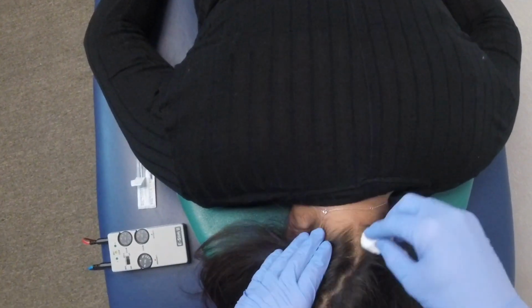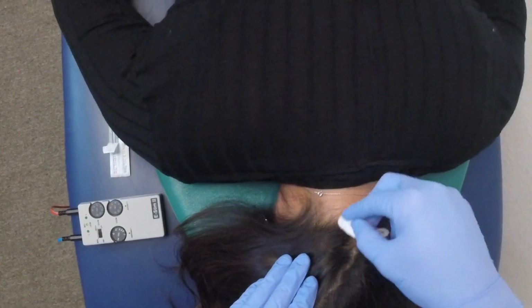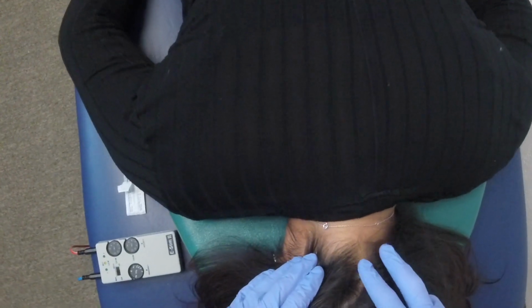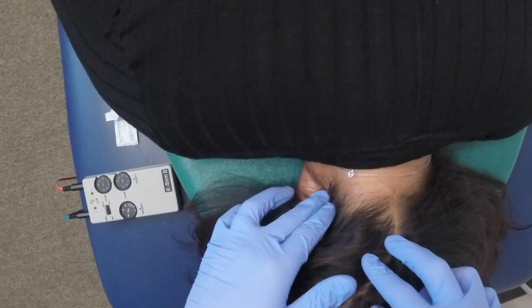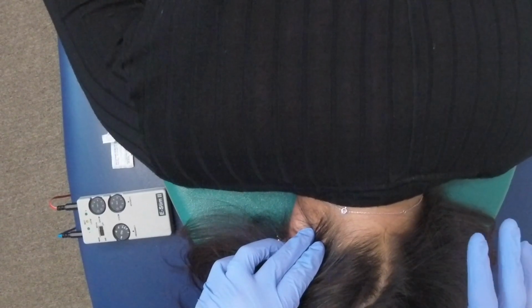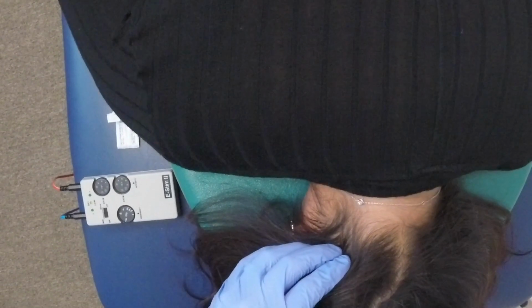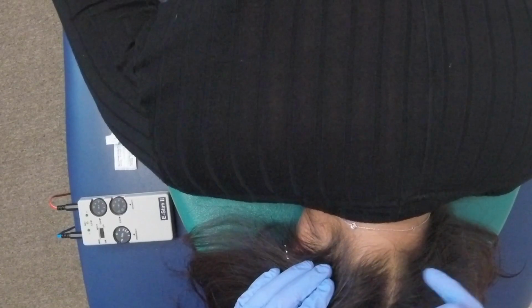All right, so first muscle we're going to do in the suboccipitals is the superior obliquus capitis. And this muscle is out laterally. It originates on the transverse process of C1, and then it comes up and attaches on the occipital bone between the superior and inferior nuchal lines. After we do that muscle, we'll slide over medially and do rectus capitis posterior major, which originates on the spinous process of C2 and comes up and attaches laterally on the occipital bone, once again around the inferior nuchal line.